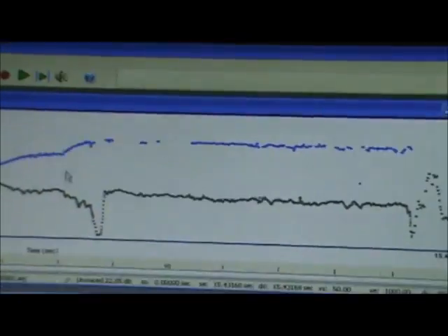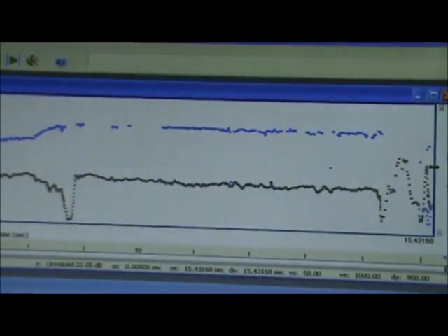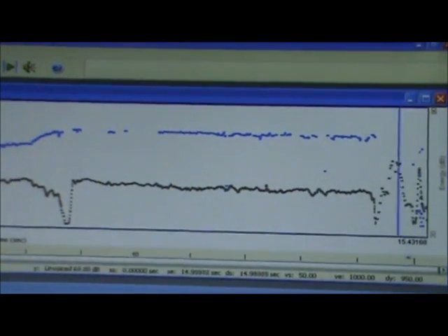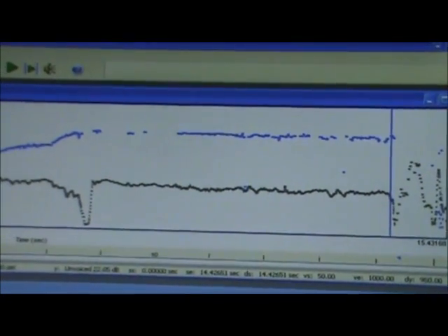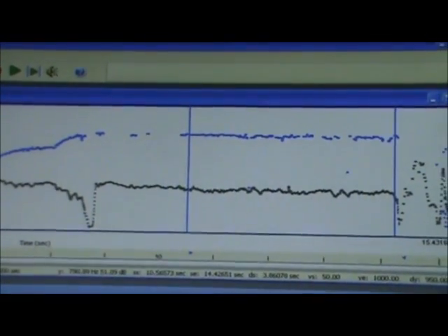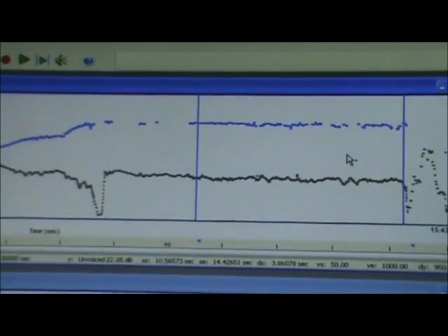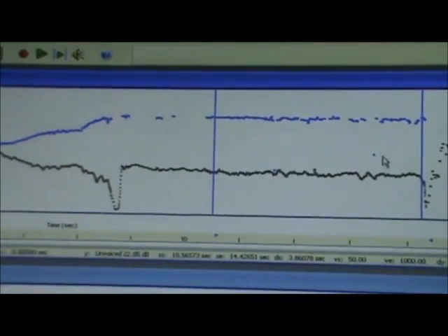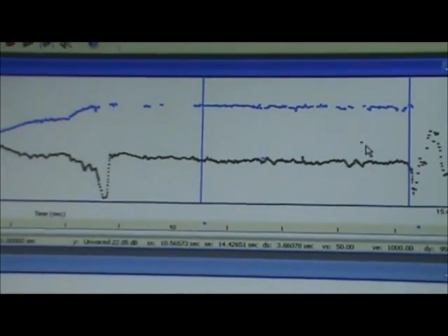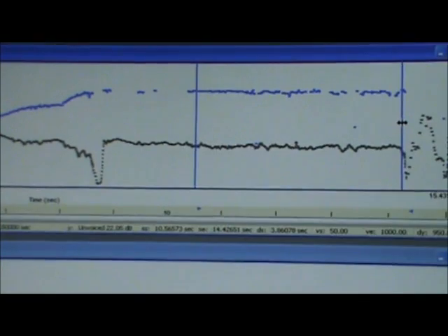Like I said, normally you'd be ready with the space bar and you'd hit it immediately, but I kind of have to hold the mic with one hand and then drop the mic and go hit the space bar for this demonstration. But again, I'm going to just drag my lines in. Now, here's one thing that's going to really mess this up. See this little pitch break right here? I don't want that in my sample because that's going to completely change my mean. And unfortunately, there's another one right there. So this isn't going to be a good sample.